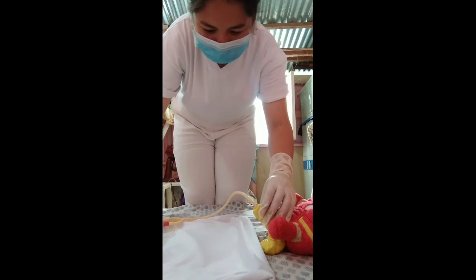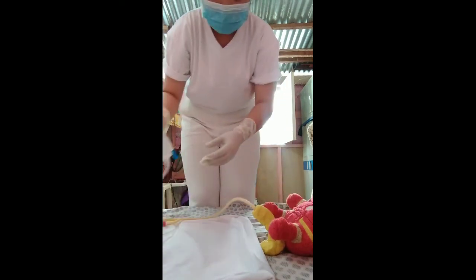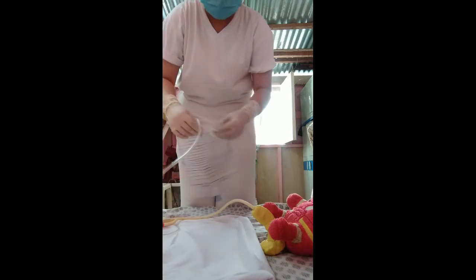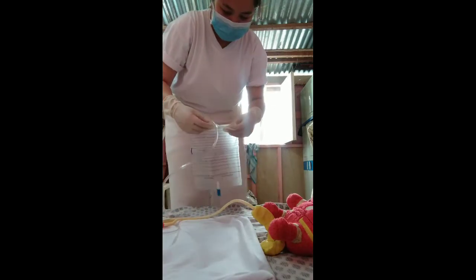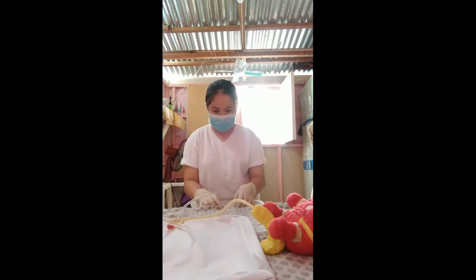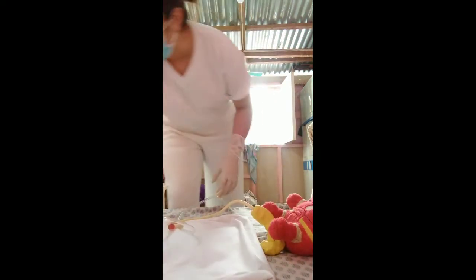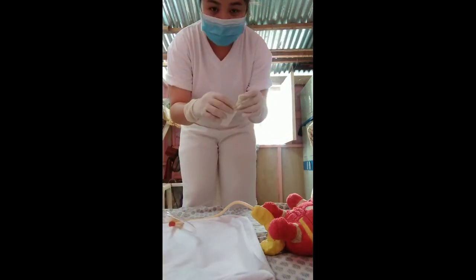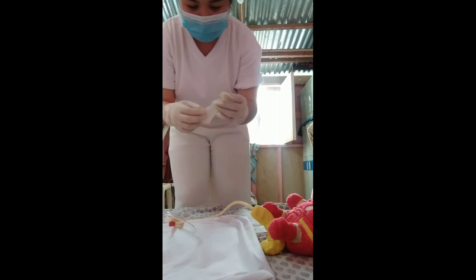Okay, so I see the urine in the urobag. We put the urobag at the bedside of the patient. And I have here an improvisation of a stabilizer. So we need to assume that this is a stabilizer.